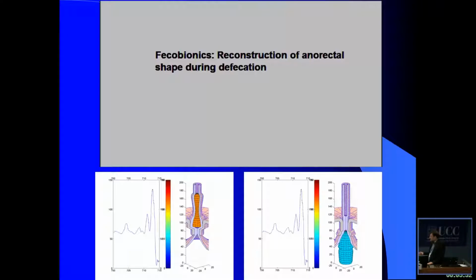Here it's being expelled, so this is outside. And all this tissue geometry here is actually computed from the impedance measurement, because we measure the luminal dimensions. And when it passes on the way out, we obtain all the data and we reconstruct the geometry of the organ afterwards. These are, of course, only two still pictures. Here it's in the rectum, here it's just being expelled.